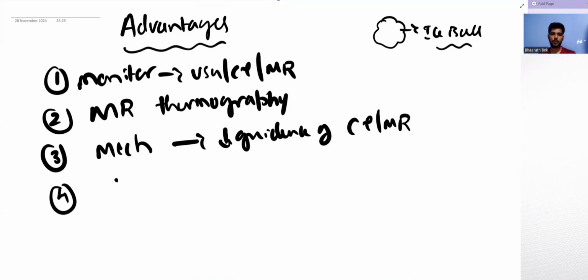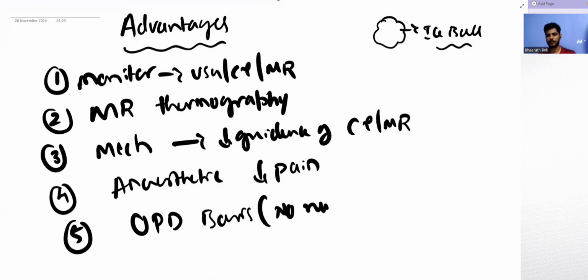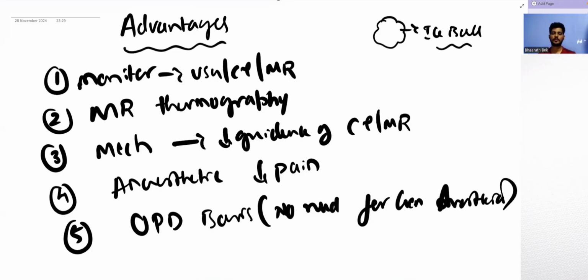And because it is cold, it is anesthetic also. So the patient feels less pain, and because the patient feels less pain, this can be done on an OPD basis also. And there is no need for general anesthesia. So these are the various advantages of cryotherapy.